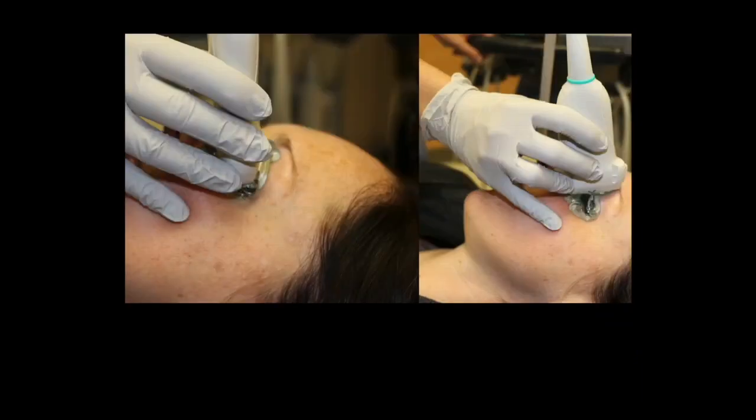When you're scanning a patient, you should be using your hand to stabilize yourself. Here you can see using the pinky to bridge yourself. If you're scanning on the other side, you can use the bridge of their nose. But whatever you want to do to stabilize yourself, just make sure you're not pushing hard onto the eye. Here you're noticing that they're scanning in both transverse and longitudinal, in two planes, as we should with every exam.